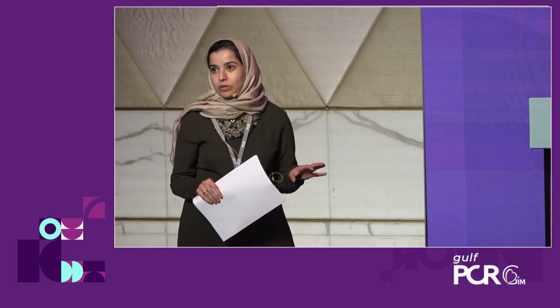But let me ask, and I want to take your opinion and the operators in the room as well. How frequently do you pre-dilate patients with aortic stenosis, whatever the platform you're using? Very good question. So with lots of platforms we don't. This is definitely a mandated one, and one of the things is that the radial strength is not as good as others, which is actually an advantage in some cases, because we had a case with right bundle and really no change in conduction and no complete heart block with it. So it's an advantage in some settings.